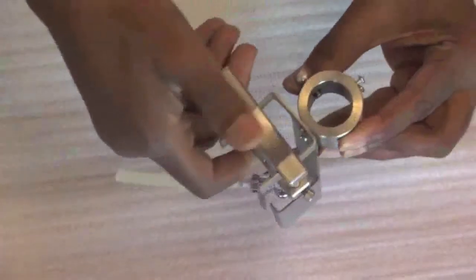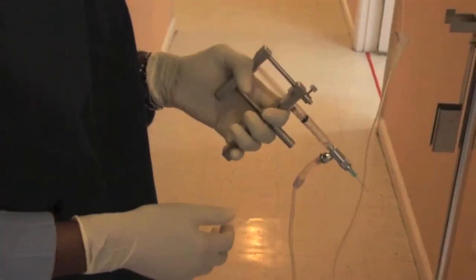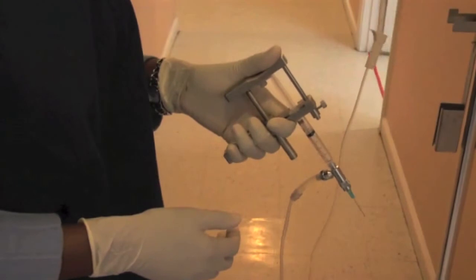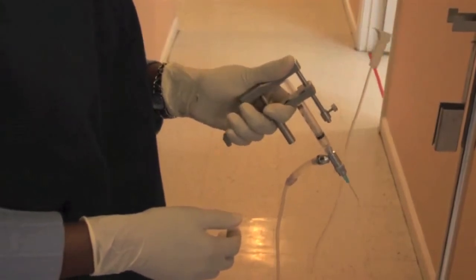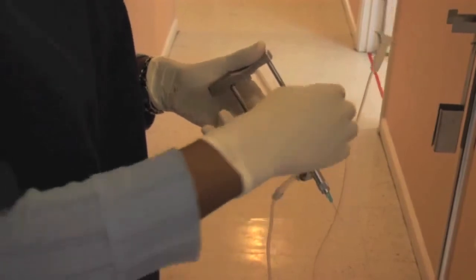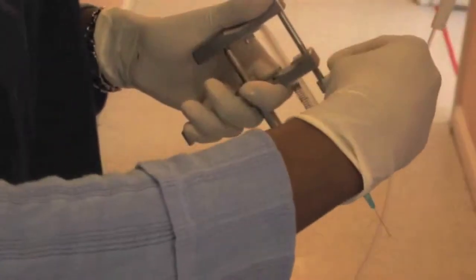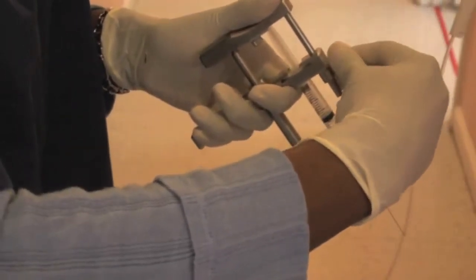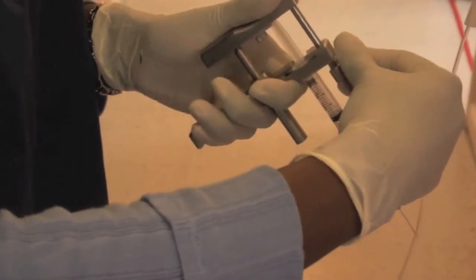The device is now attached to IV tubing which delivers tumescent solution with epinephrine or local anesthetic.